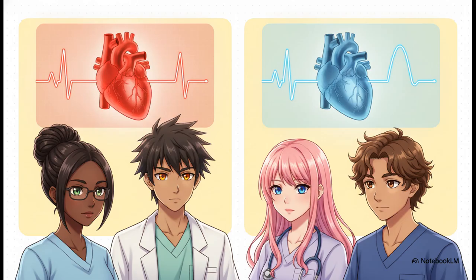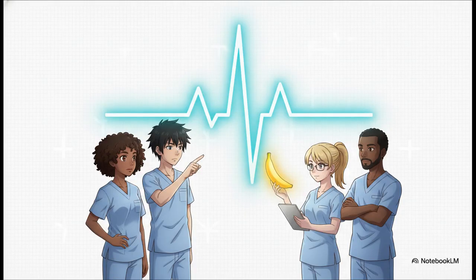Notice how the very beginning and the end of a single heartbeat are framed here. That first little bump you see, that's the P wave, and it represents the atria contracting, or depolarizing. The final major bump is the T wave, which shows those massive ventricles relaxing, or repolarizing, basically getting ready for the next beat. Let's rapid fire through some more golden exam points.